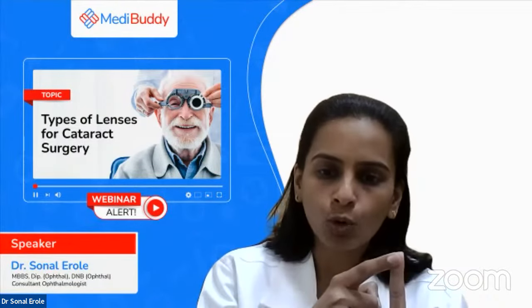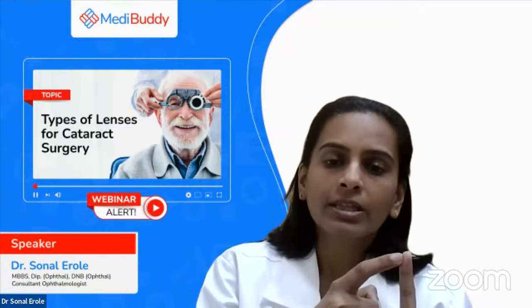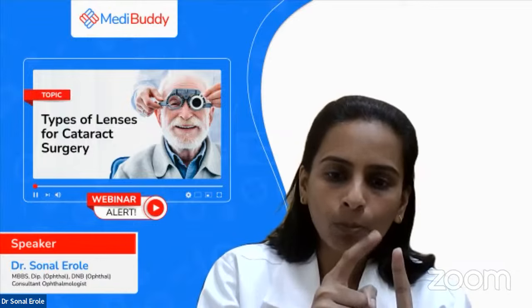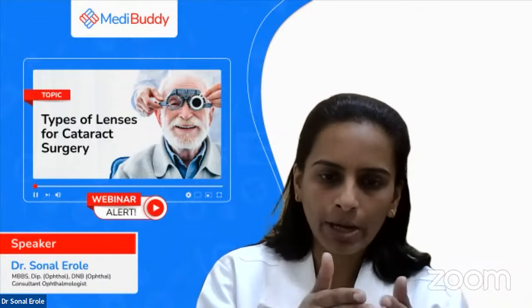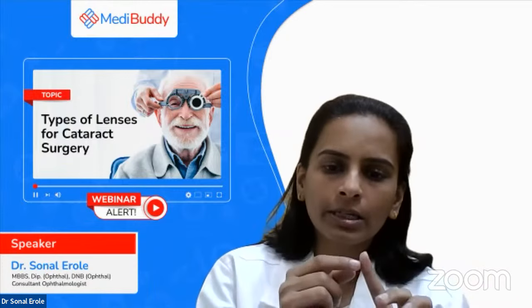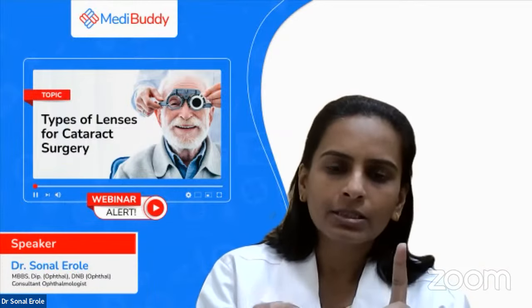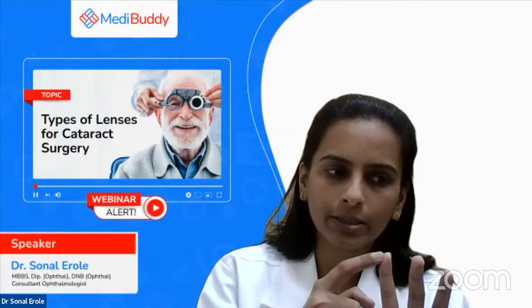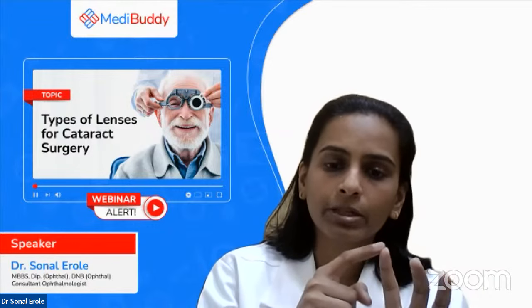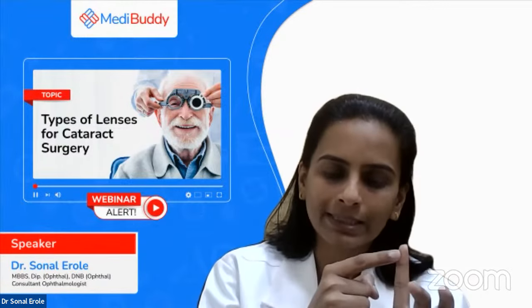They have a yellow coating. What these yellow lenses do is protect your retina from blue rays. It is said that the blue rays of light are a little harmful for your retina, and as age increases, this harm is a little more. So the yellow colored lenses will protect your retina from this blue light.